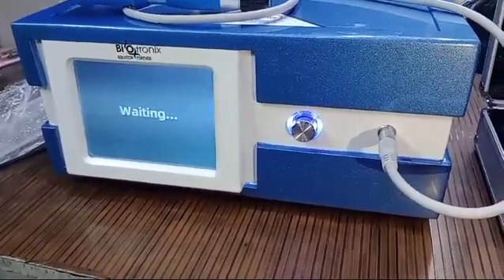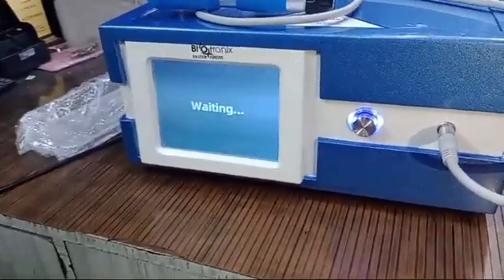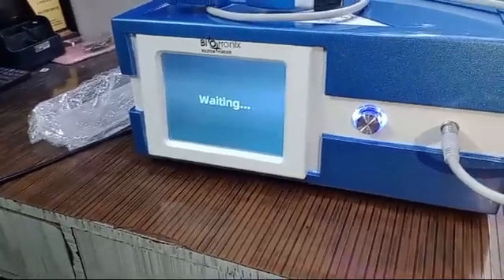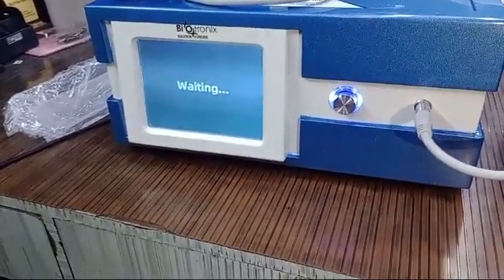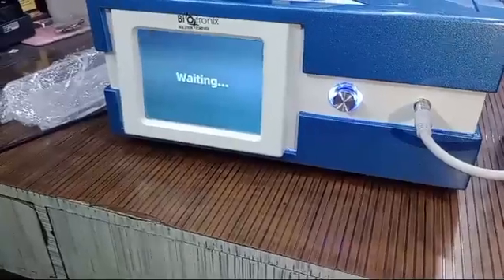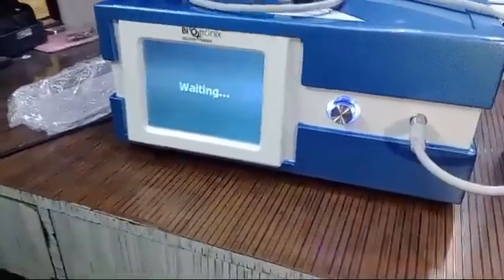The machine is getting switched on and the internal compression is getting ready. Press the screen and you will see 10 treatment areas: elbow, knee, shoulder, ED (erectile dysfunction), hand, lumbar region, foot and ankle, and a slimming mode for fat accumulation.